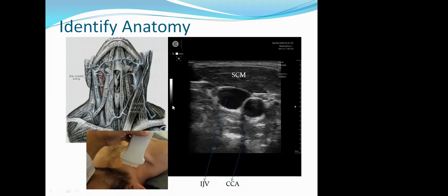So always check the correct position of the probe. Now, when you put the probe on the neck, you will see on the top the skin of the neck, and this one is the sternocleidomastoid muscle. Then you will see one rounded structure and one structure of a bigger diameter. The rounded structure is the common carotid artery, and the bigger one is the internal jugular vein. So these are the two structures.